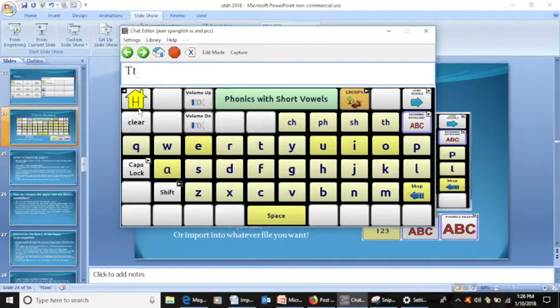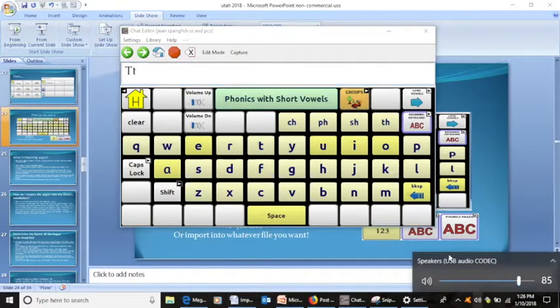No, I didn't hear that. Wonder why. You're going to have to practice on your own, because this just says the USB audio. Oh. So you don't want me to unplug that and plug it back in, do you? Yeah, you can do that. Okay, let me try this. Okay.